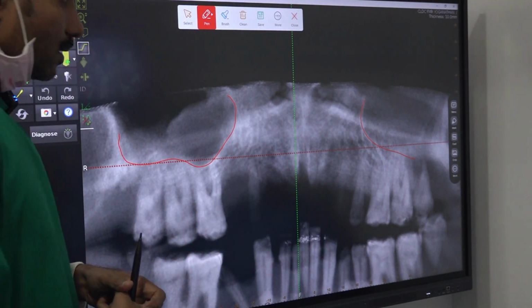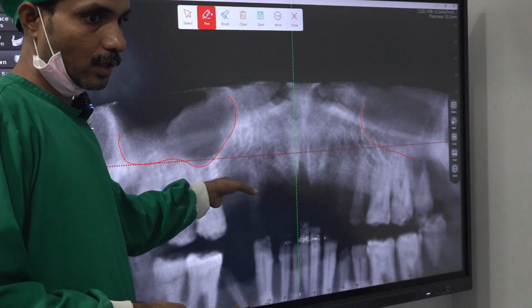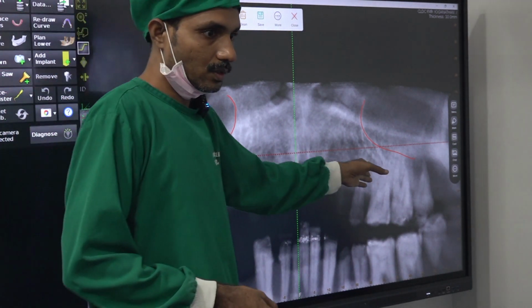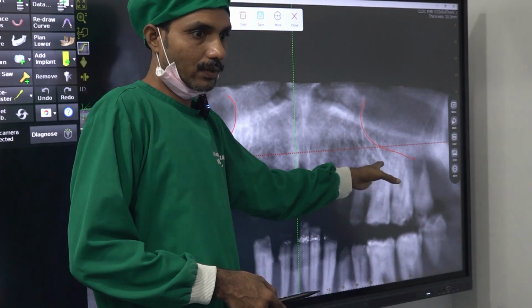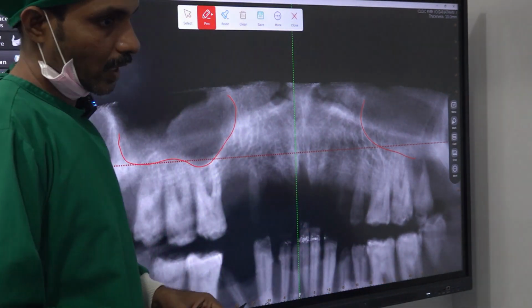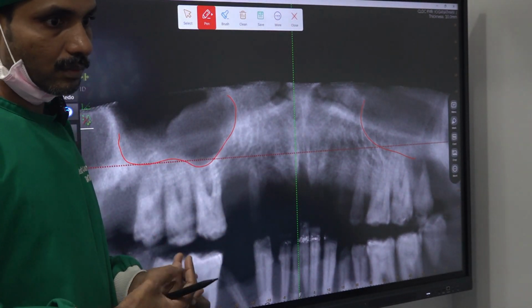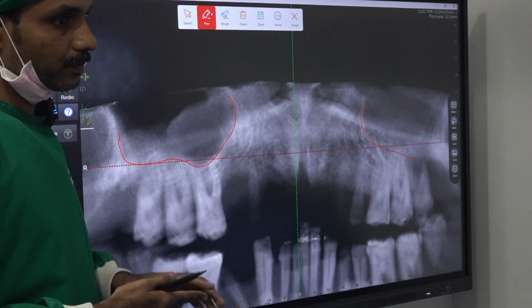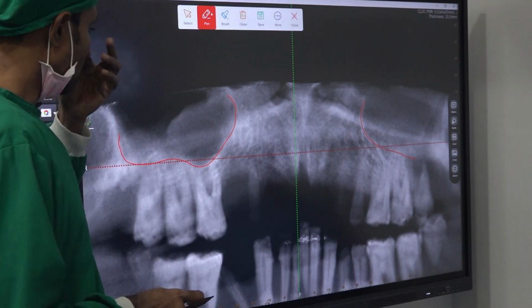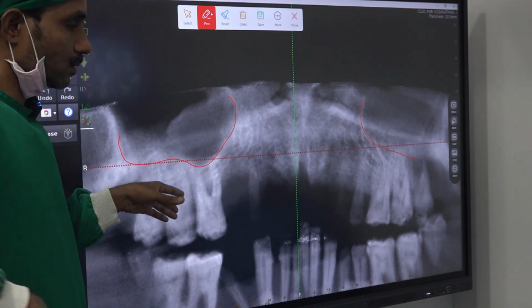In some cases what we did, there is no bone in the 4 or 5. The last case, there is no bone in 5. From 4 only our implant starts. Ideally zygoma was needed, but we avoided zygoma by using pterygoid, by using multi-unit and titanium frame. See, zygoma.